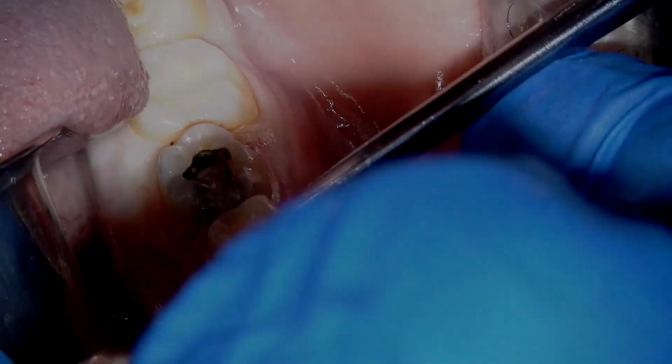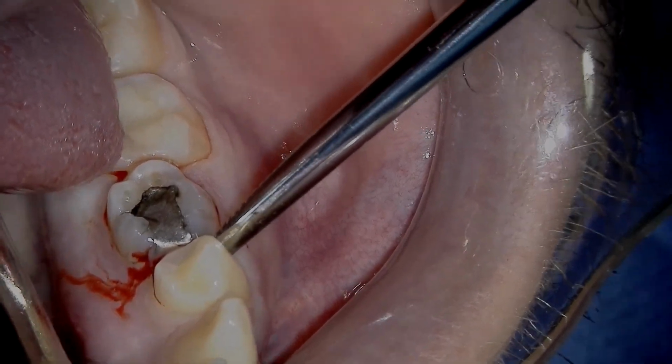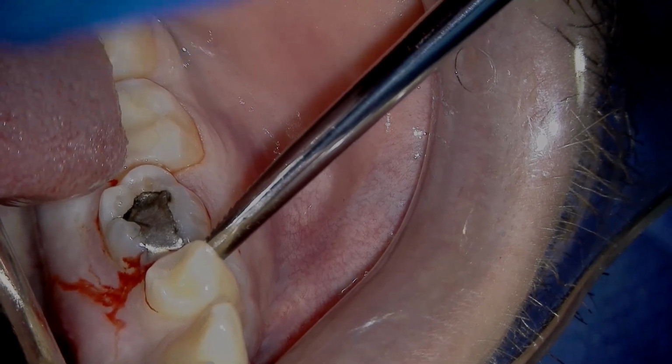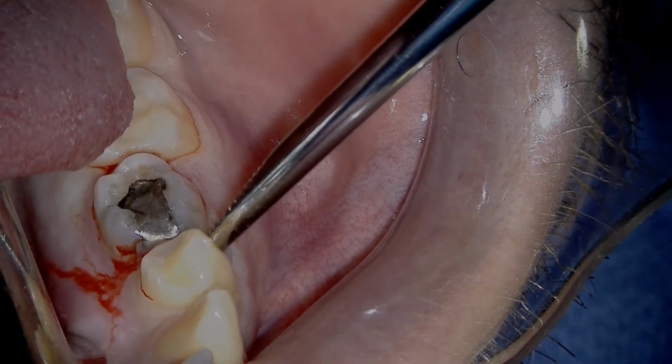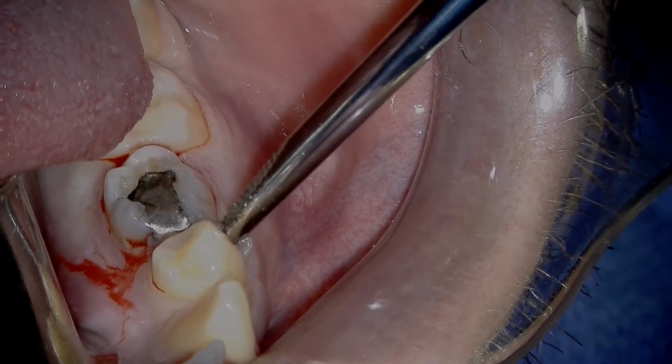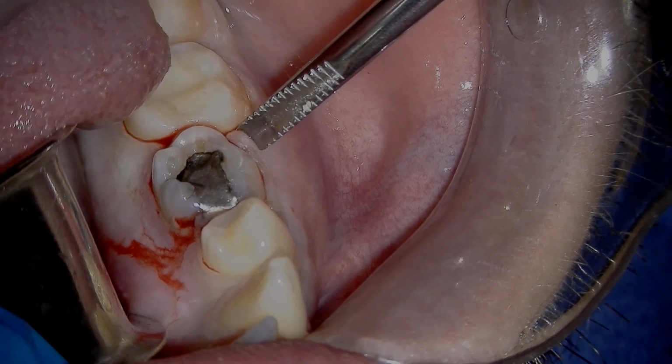And then I use an easy out elevator. It's a little bit different than a straight elevator. You use it up and down the long axis of the tooth, and it's just a rotation motion. And sort of the teeth of the elevator will just lift the tooth up instead of buccal lingual.